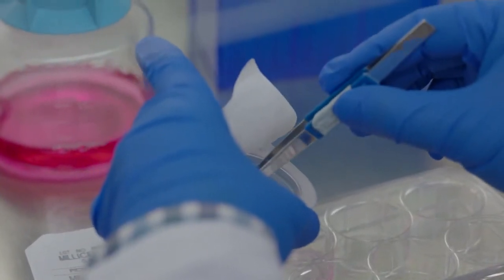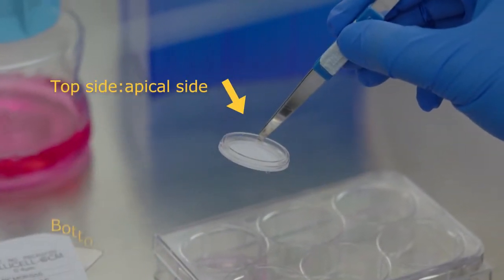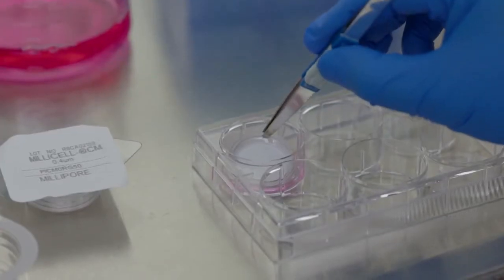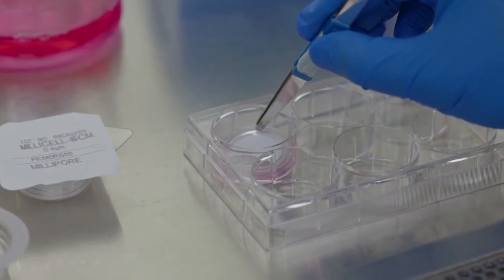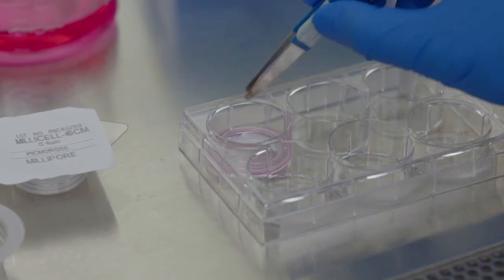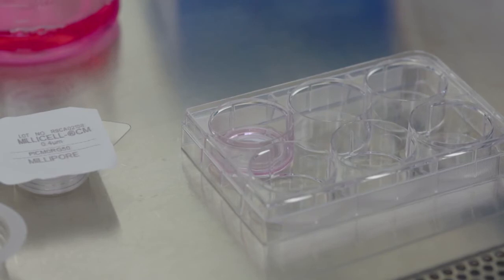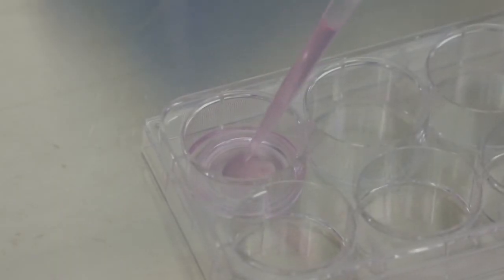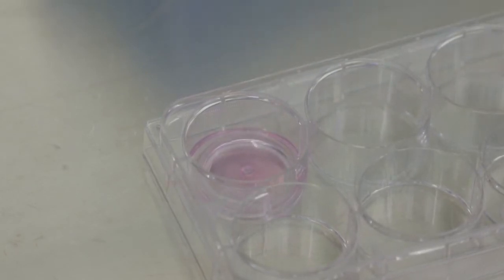Now, let's place the insert into the well. As you can see here, it is best to place the insert slightly at an angle so as to avoid trapping of bubbles. There you go, now you have it. Now you're ready to start with your experiment of choice, such as placing a tissue slice or adding appropriate media with cells.